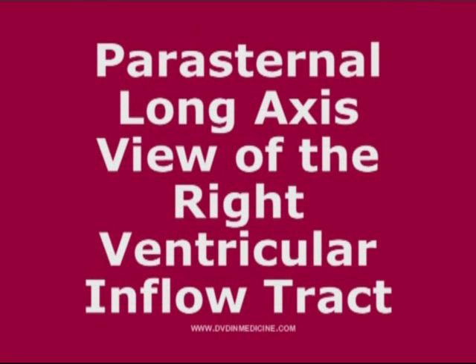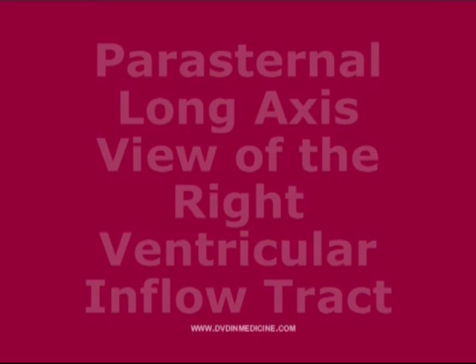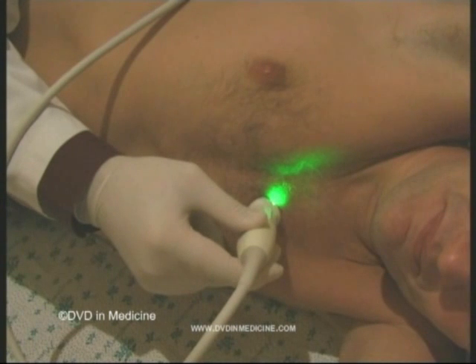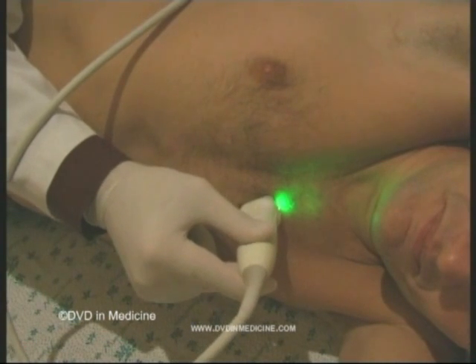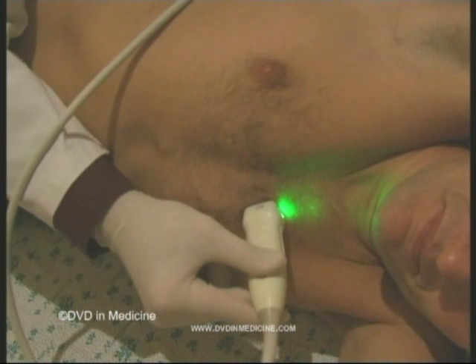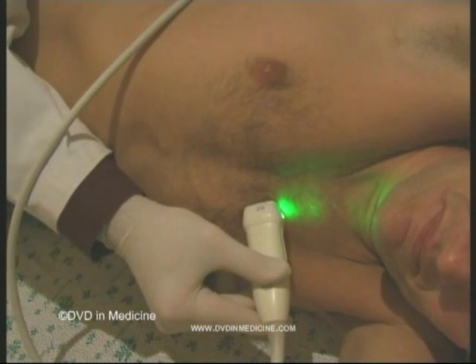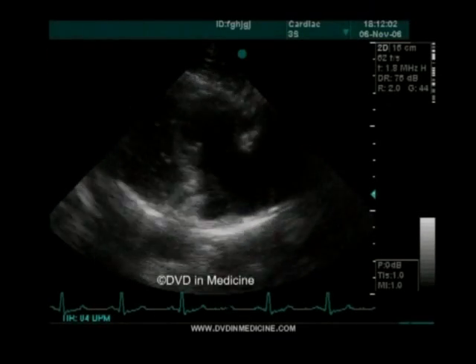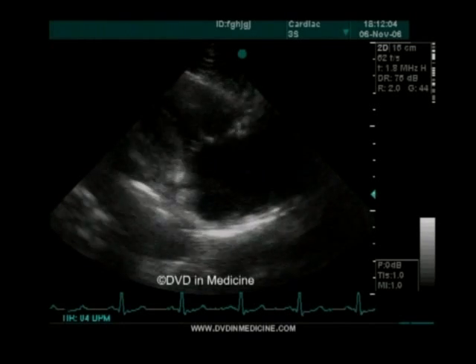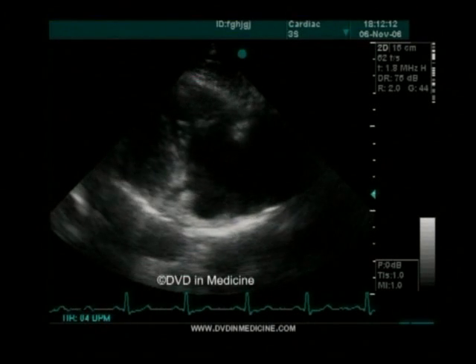Parasternal long axis view of the right ventricular inflow tract. After one has obtained the parasternal long axis view of the left ventricle, one can rotate the transducer a bit clockwise and angle it as if one is trying to look under the xiphoid process. In this image, one can see the position and motion of the tricuspid valve leaflets.